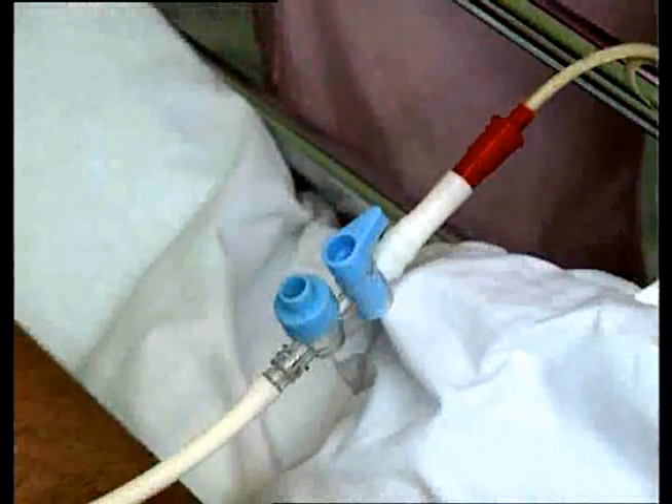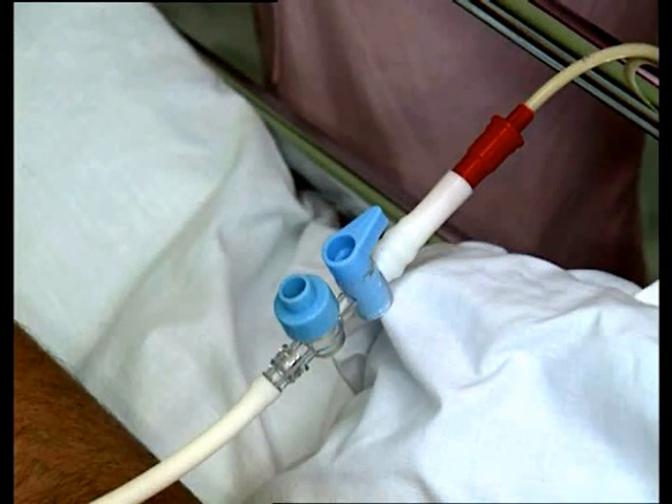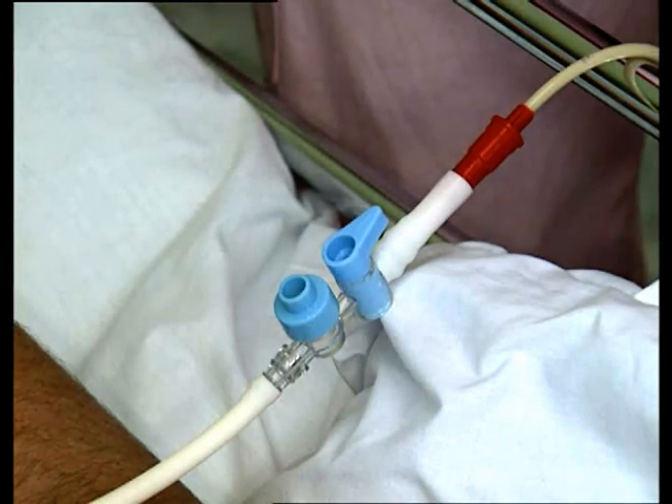Its streamlined profile minimizes obstructive bulk, and this one simple device connects to Salem Sump, Levin, and Peg G-tubes, eliminating the need for cumbersome 5-in-1 connectors and expensive enteral feeding Y-port adapters.